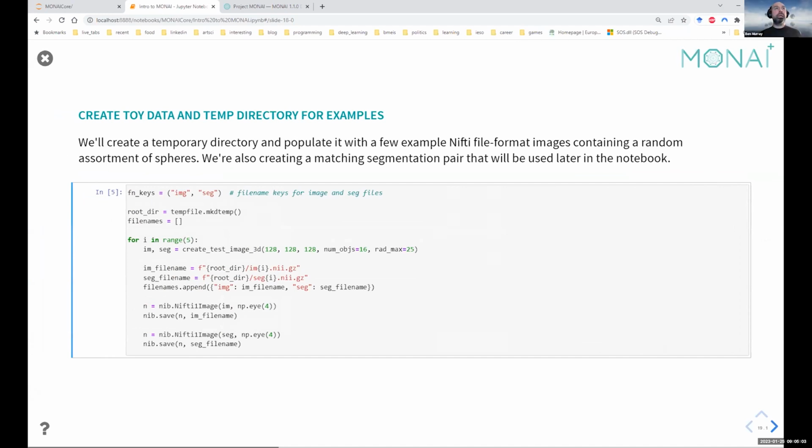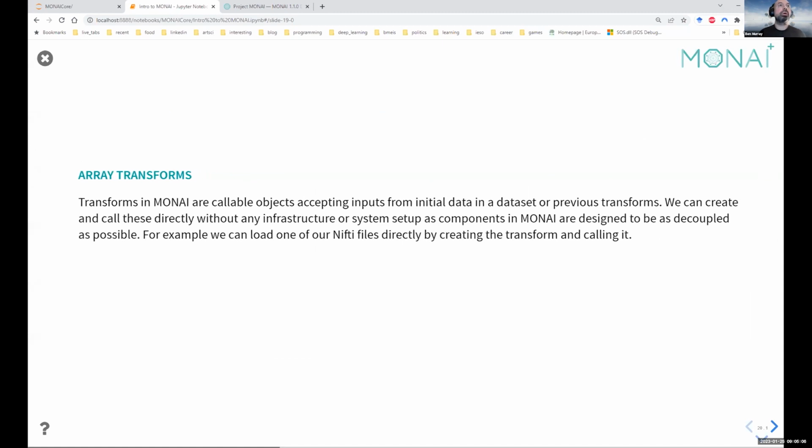Yeah, I think so. Okay, so the first type of transforms we'll look at are array transforms. As I say, some libraries only provide array transforms. And when I say an array transform, typically I'm talking about a transform that takes a value, typically a tensor, and returns a value, typically a transformed tensor. And obviously you need multiples of these if you're dealing with multiple channels, if you don't want to do precisely the same operations on your images and your labels.